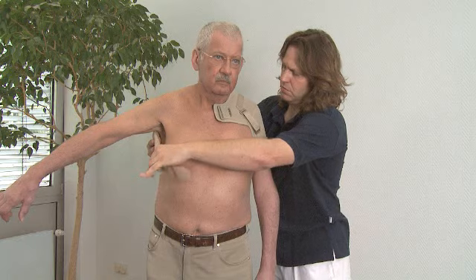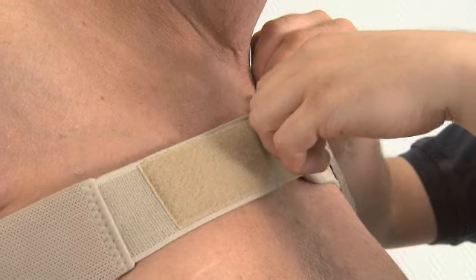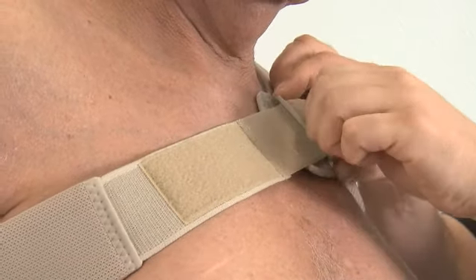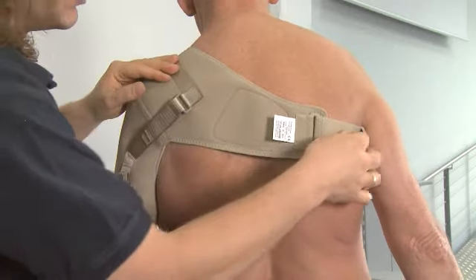Take the strap through the patient's unaffected armpit and close the strap on the chest side. If necessary, adjust the strap on the back as well.